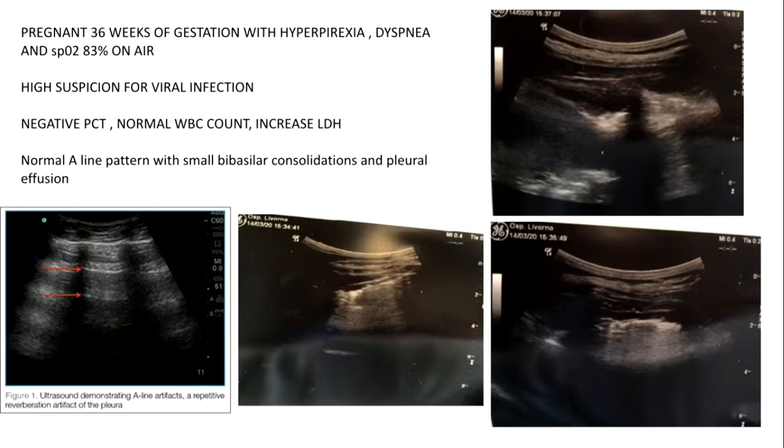scan, we can in part rule out a very dangerous pathology in a pregnant woman, in which you cannot perform X-rays or CT scan. No question, ultrasound is really, really important here. We cannot overemphasize this, and I'm glad that you're mentioning this on so many occasions as well.